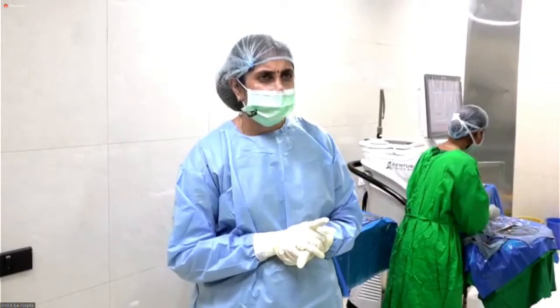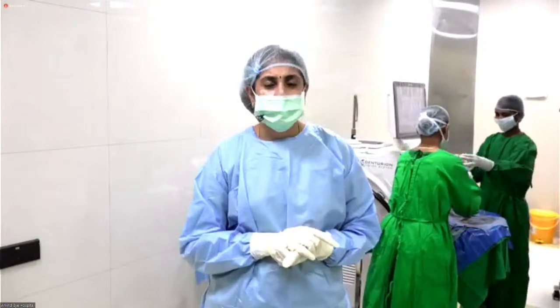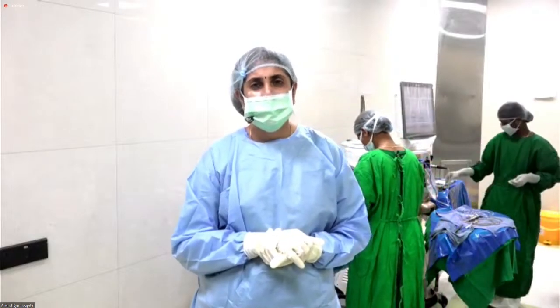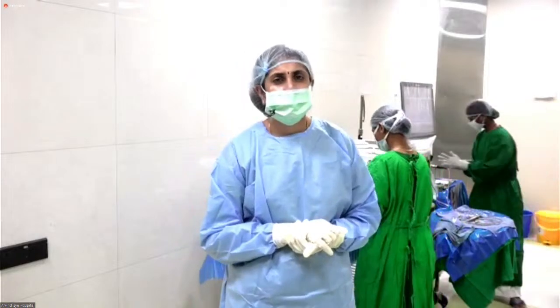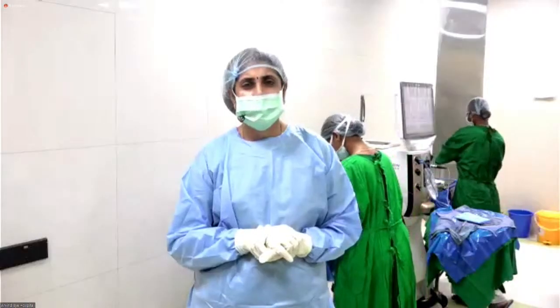Yeah, absolutely. I think there was one interesting paper at the ASCRS where they planned a 0.8 residual in the non-dominant eye, and the patient actually had excellent binocular vision. So if you have a little residual, it definitely helps. A minus 0.8, yes. And it will be really wonderful to look at the aberrations of these lenses, because the diffractive plates that are there in many of the lenses create many of these aberrations because they split the light. But lenses which do not have diffractive plates all throughout might be better off in terms of aberration profiles. That's true. Yeah. I think we have a lot more to explore on these platforms, for sure.